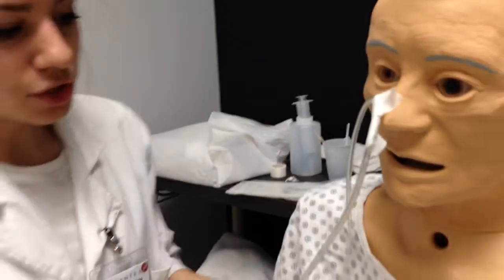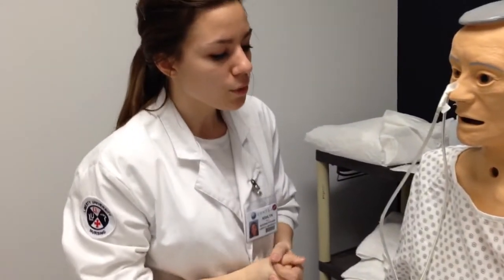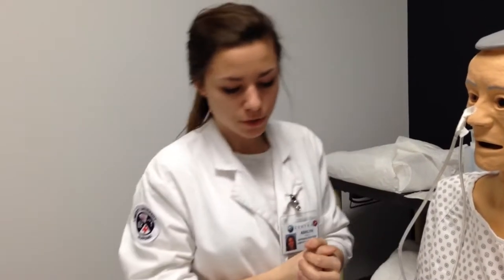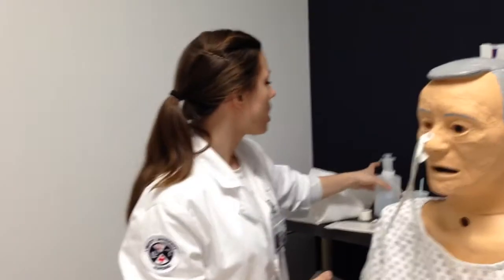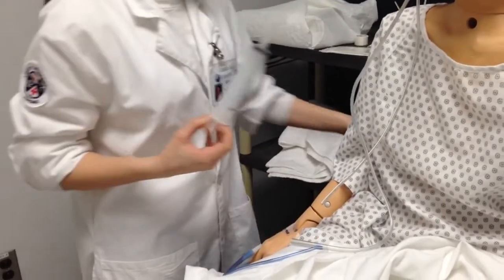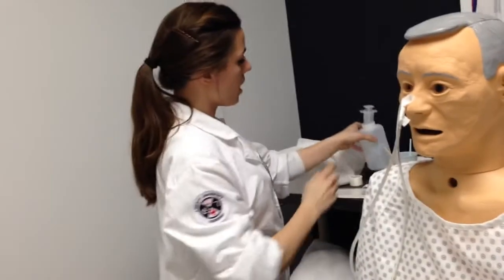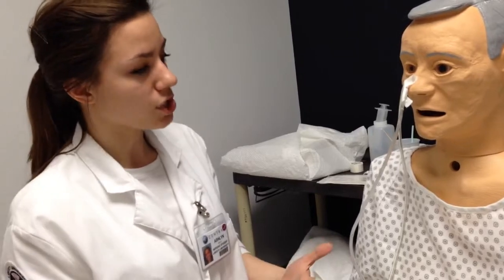Alright, and then to ensure that the placement of the NG tube was in the stomach, the golden rule is to do it with an x-ray, but we wouldn't do it with an x-ray. You could also test it using a pH test, in which I would aspirate gastric contents from the tube and measure them with the pH, making sure that it was acidic, or I could auscultate over your stomach, making sure that I heard a swishing sound.